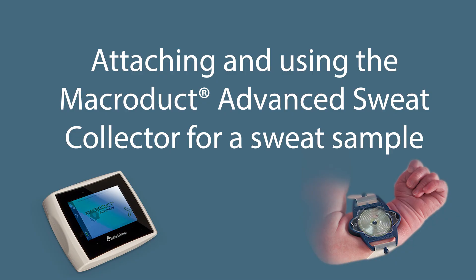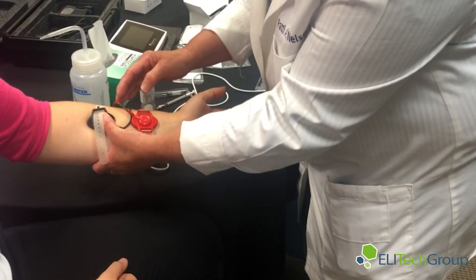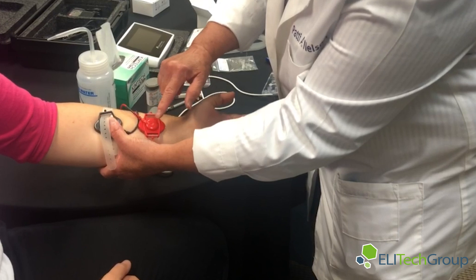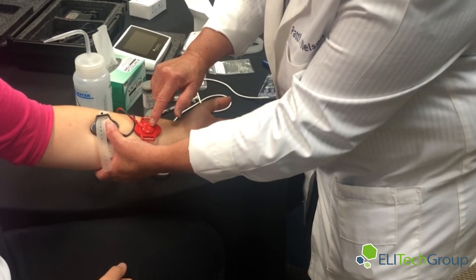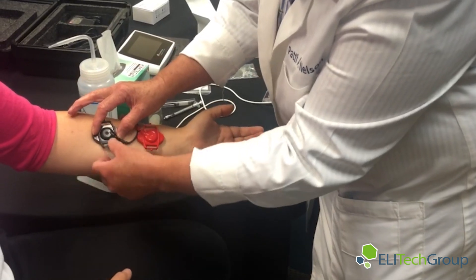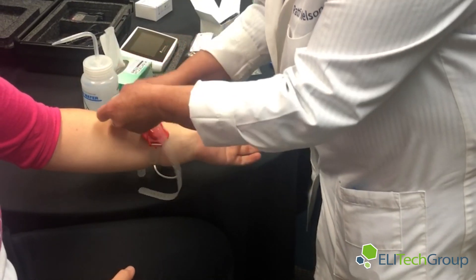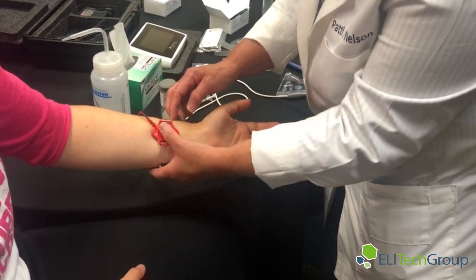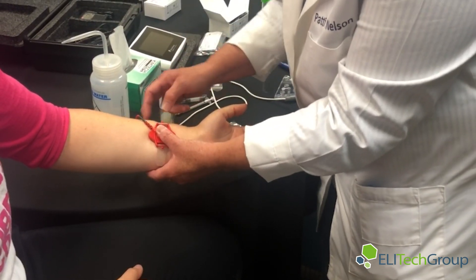Our arm iontophoresis is completed. We'll remove the electrodes. Keep in mind which one is the black electrode and which is the red electrode. The red electrode is what we're going to use to collect — that's the one where the sweat will be stimulated. We'll remove the black electrode from the arm, and now we're going to work with the red electrode.